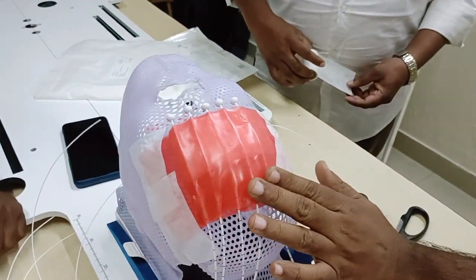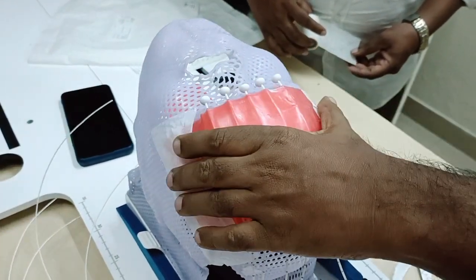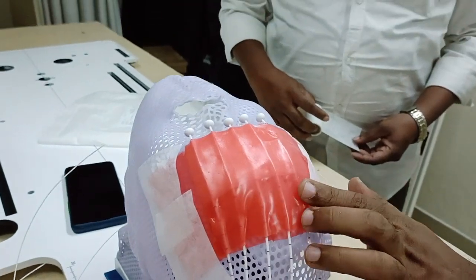How to make a mold preparation — though it is very easy, for newcomers it is a good thing to learn. Thank you.